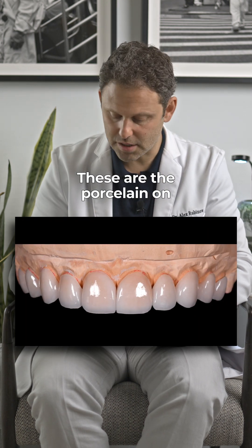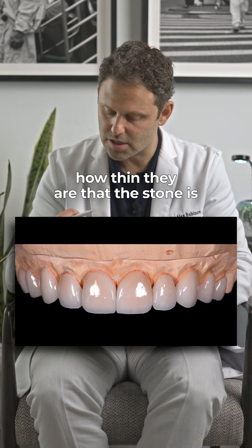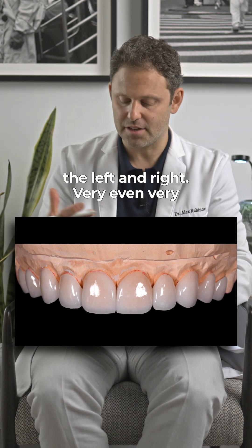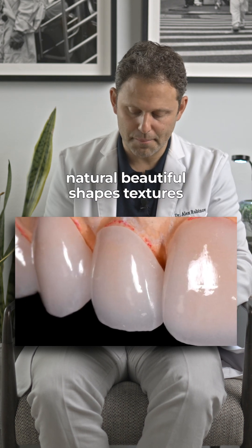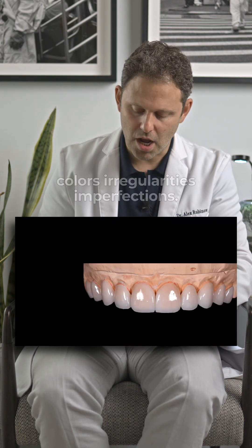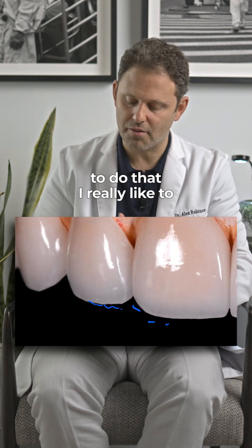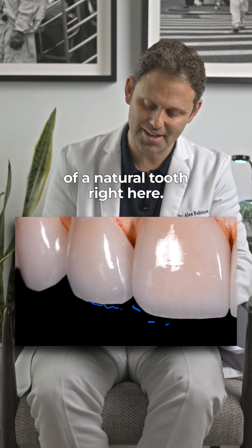These are the porcelain veneers on the model. You can see how thin they are — the stone is basically bleeding through in the back. But now we have the left and right very even, very natural, beautiful shapes, textures, colors, irregularities, and imperfections. When patients allow me to incorporate that, I really like to. The translucency of a natural tooth is captured right here.